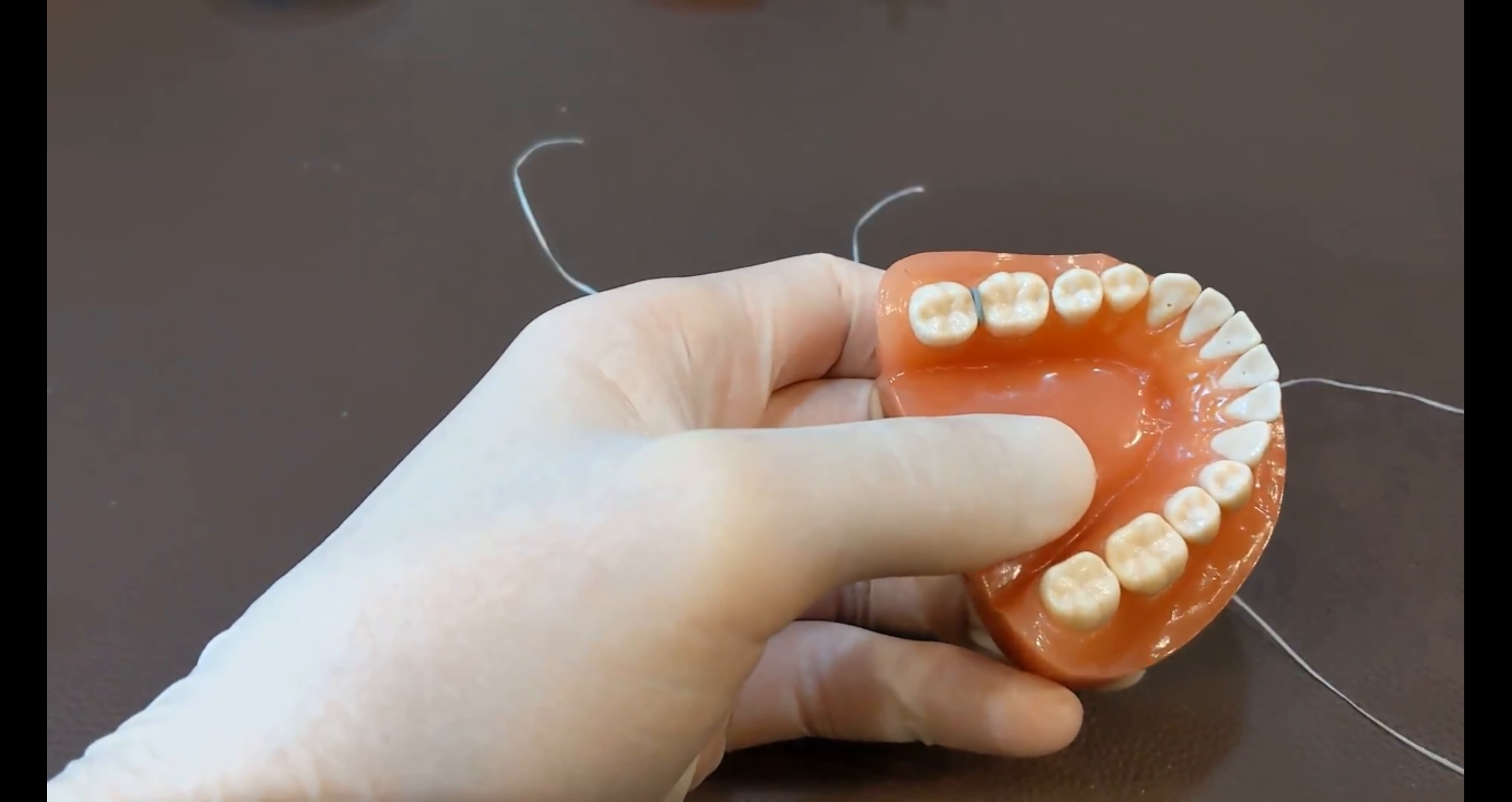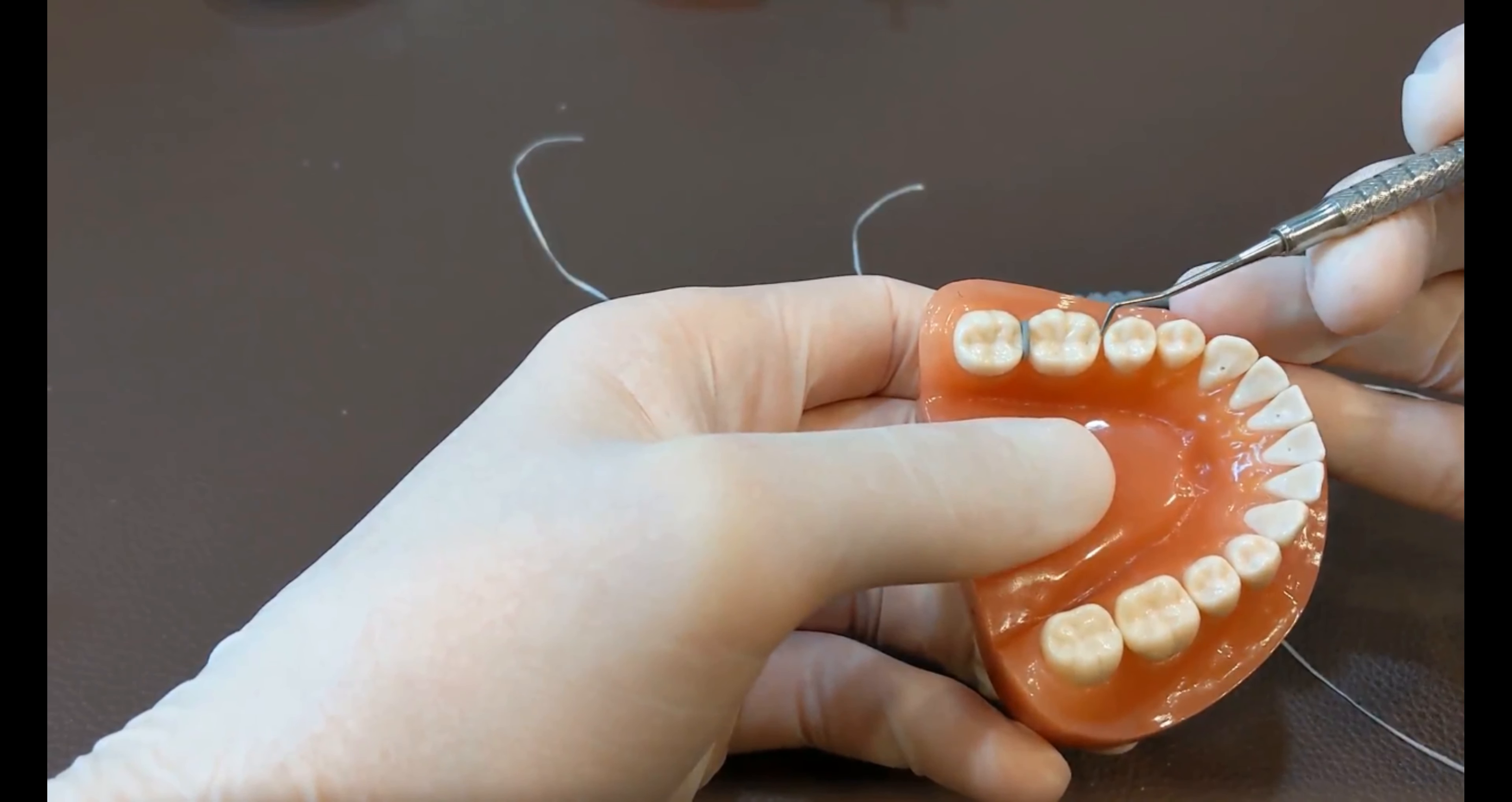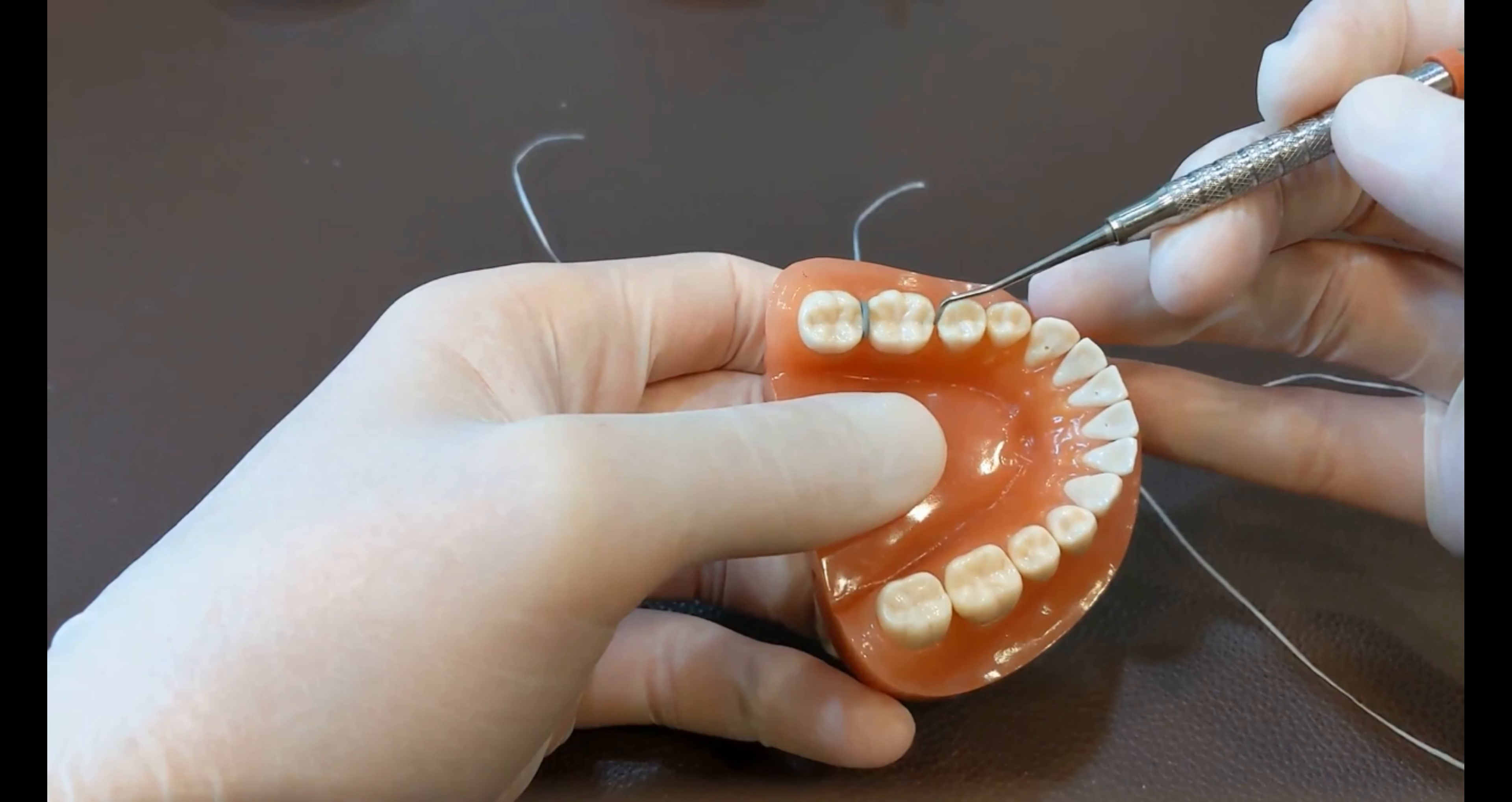To place a separator between the teeth, the reason you would want to place a separator is to open up a little bit of space in order to place a band at the next appointment. A band fits all the way around the tooth, so you need to make a little room here.